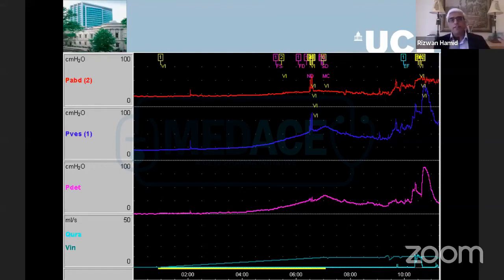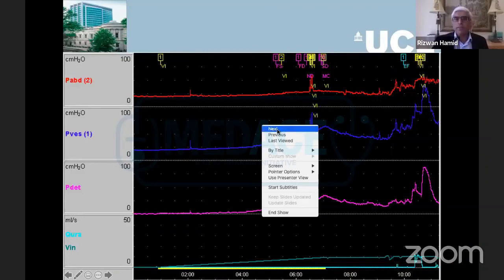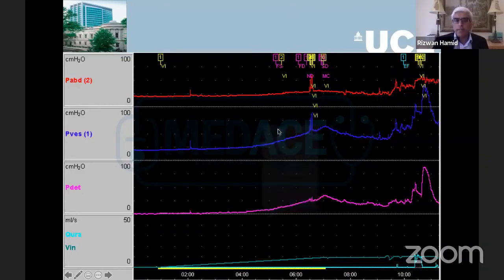On the other hand, that 24-year-old lady with endometriosis and no feeling, she might have a capacity of 500 mils. If you start filling her at 20 mils, you'll be there all day. So you need to know from the frequency volume chart and then adjust the fill rate. And the ICS recommends that for the neurogenic patients, it should be about 10 to 20 mils per minute.